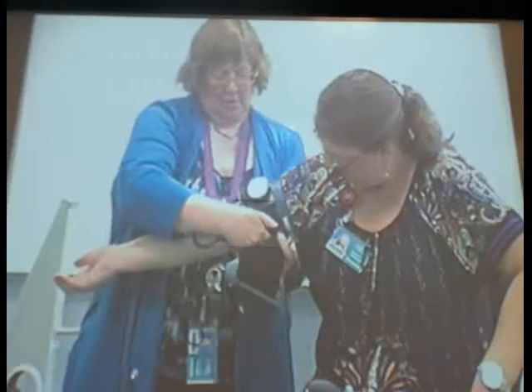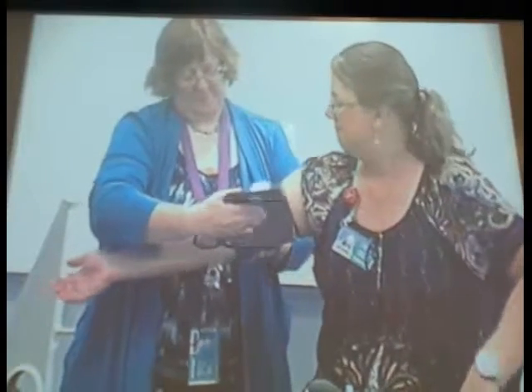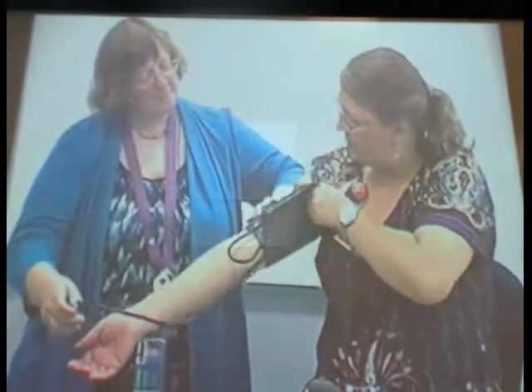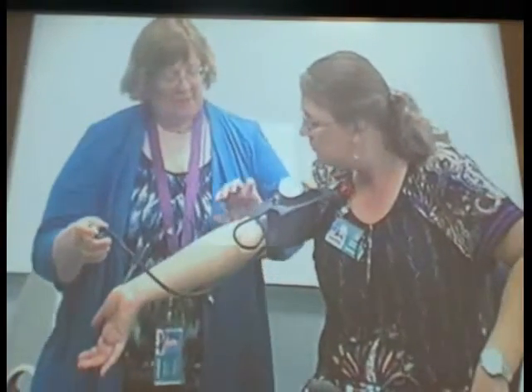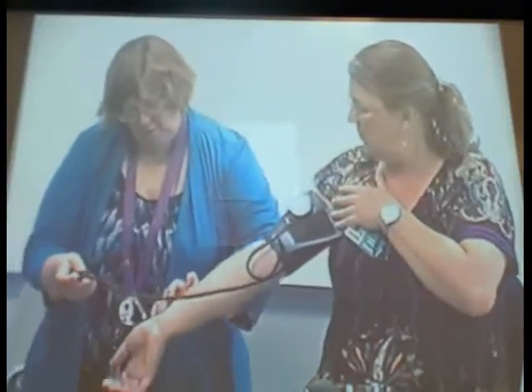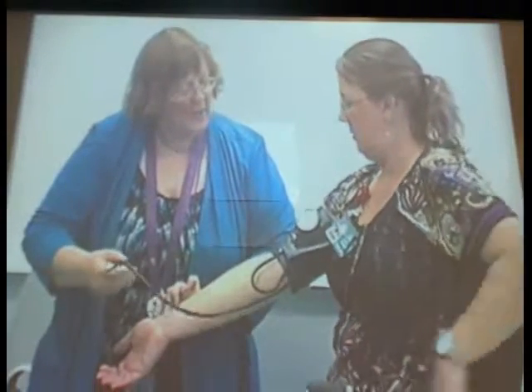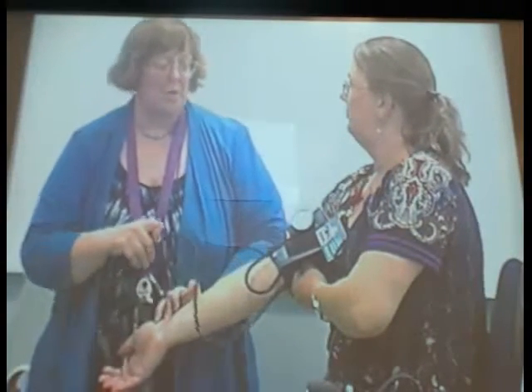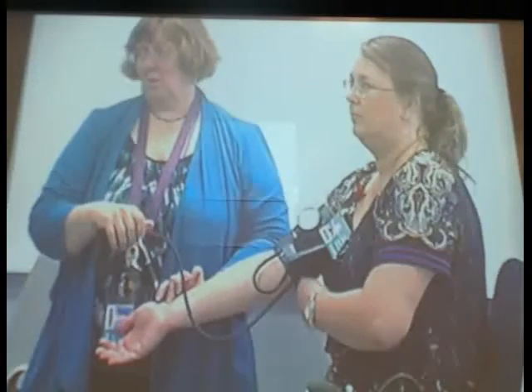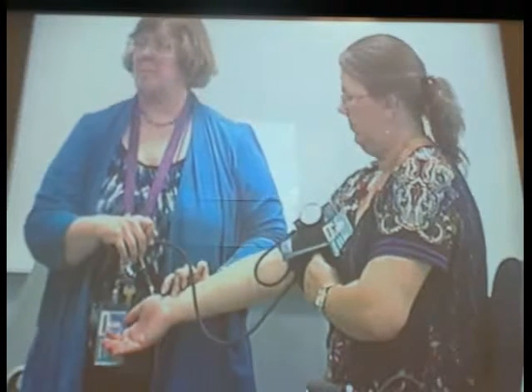I want this arrow pointed to the brachial artery and I'm going to tighten the cuff. Ideally you want it on skin, not clothing. It should feel snug without being too snug. Before taking the reading, the patient should be seated in a chair with back support, legs uncrossed, and feet flat on the floor — that's the best way to get an accurate blood pressure.